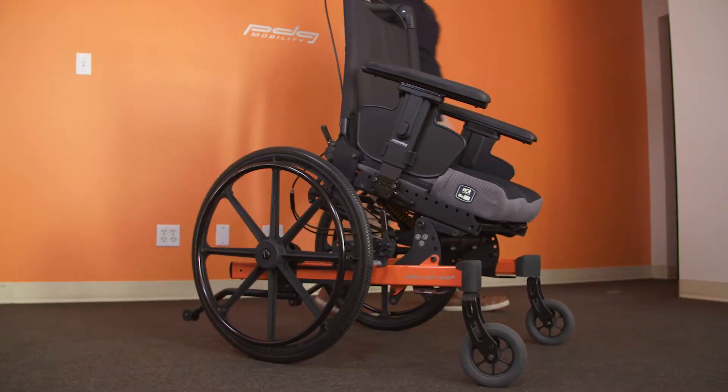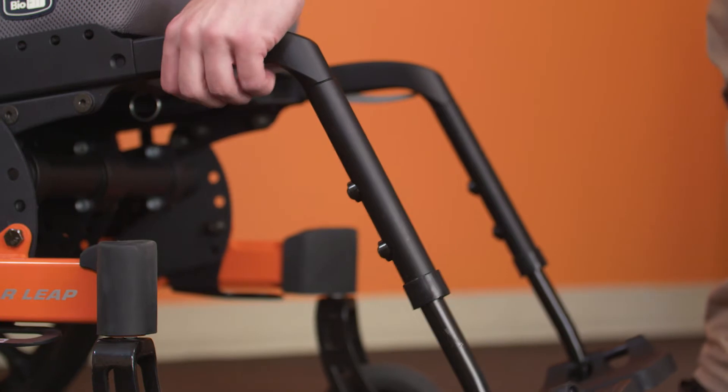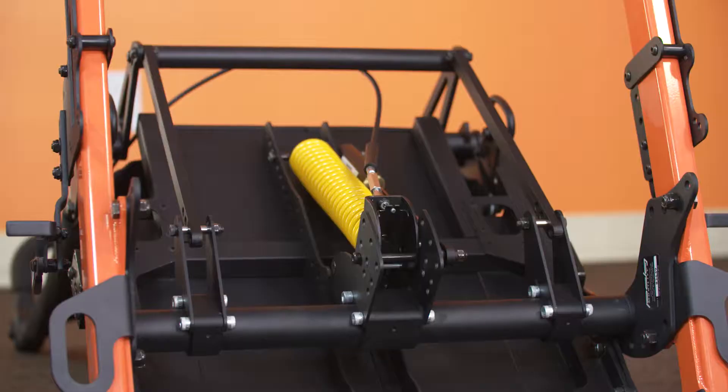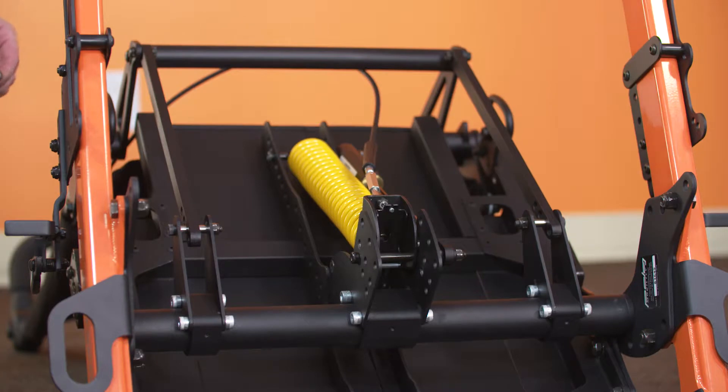Begin by removing the armrests, cushion, front rigging, and rear wheels. Turn the chair over so that the lower frame is facing upwards. Then remove the angle adjustment fastener on both sides of the chair.